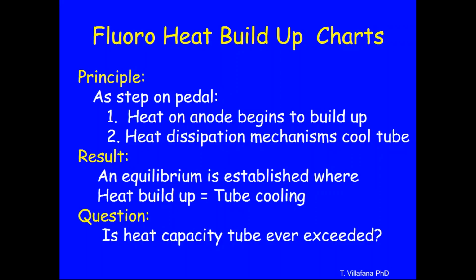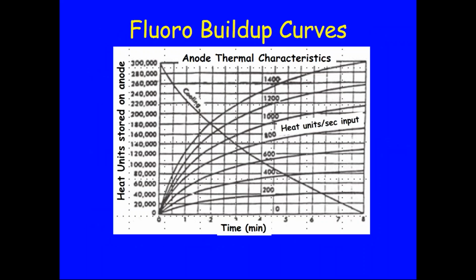In a very extensive procedure where you have your foot on the pedal for extended periods of time, have you ever wondered, gee, am I going to blow up this tube? How do you figure that out? That's where these charts come in.